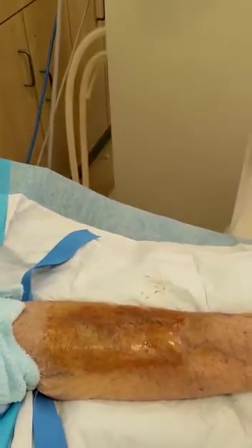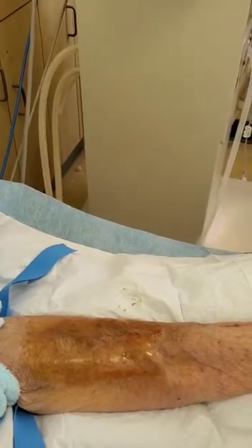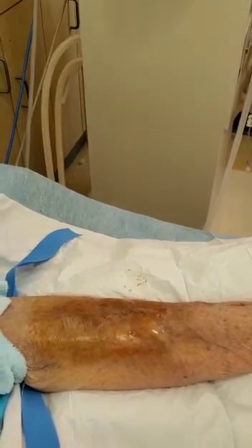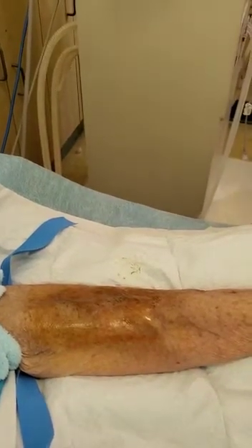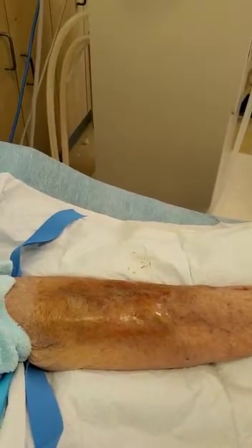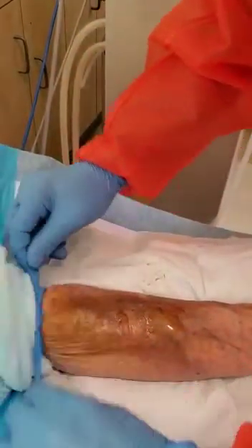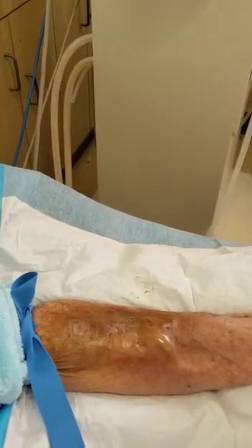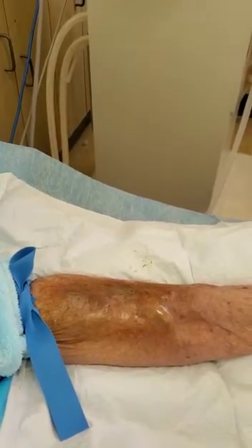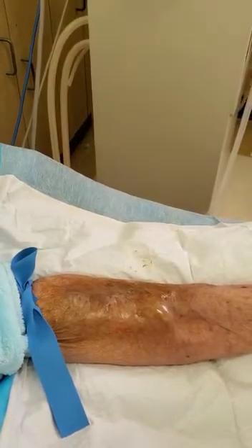Now he's going to change his gloves and sanitize, then apply the tourniquet. Remember, you always use a tourniquet when you cannulate a fistula — that's going to plump up the fistula so it's more visible, and it also stabilizes the fistula so you can get an accurate cannulation.